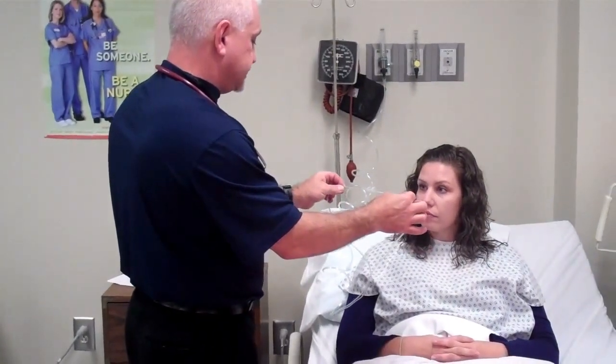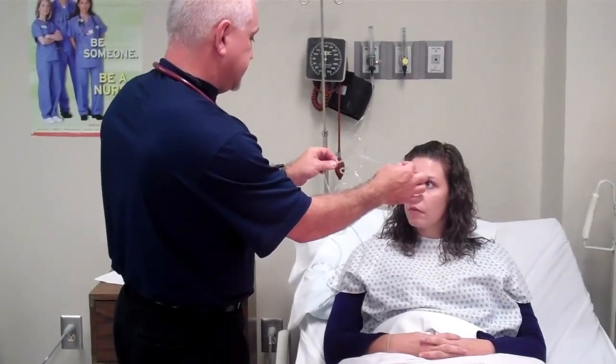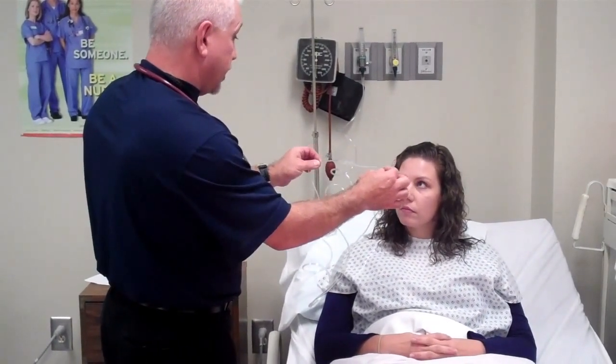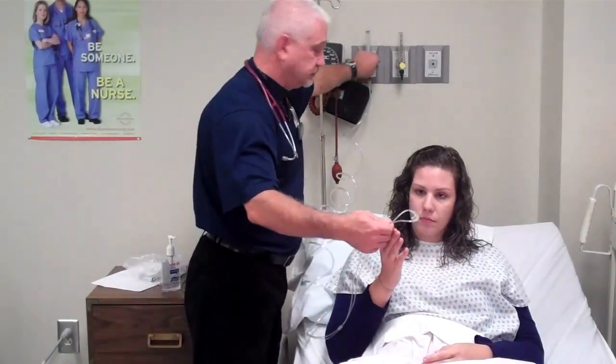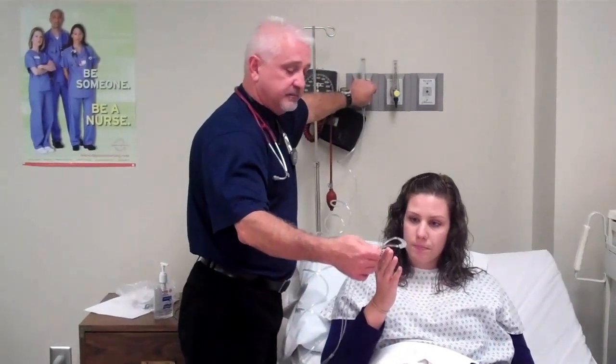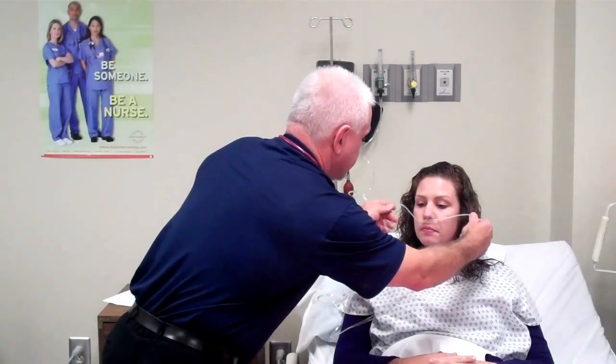You see those 2 little prongs there, Miss Hatch? Mhm. Those prongs will be sitting inside of each side of your nose, and it'll be providing oxygen in a low flow. I want you to kind of feel the flow. Okay? Now at this point, since the patient has felt it, I will go ahead and place the nasal cannula on the patient.